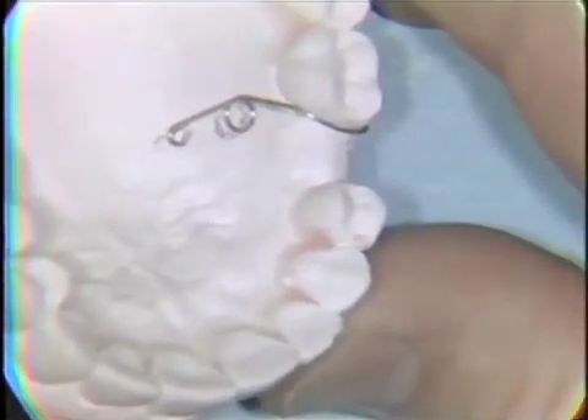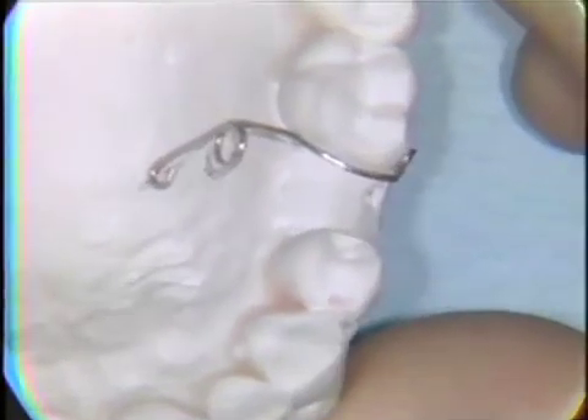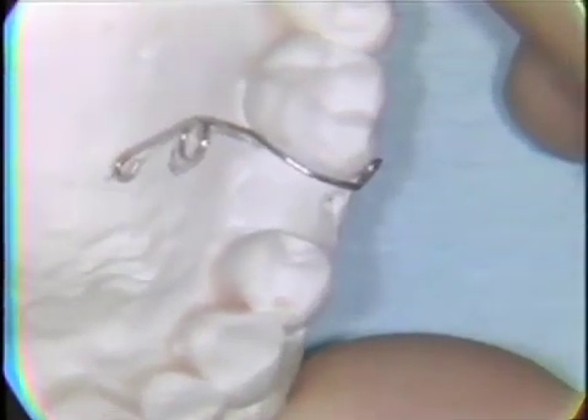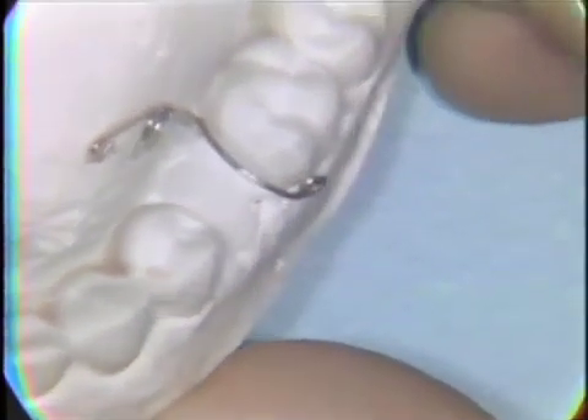The completed fingerspring should have the proper spring design to produce the most effective tooth movement. The helix should unwind in activation. The acrylic extension of the spring should be occlusal to the loop of the helix, and the spring arm should be to the gingival. The spring arm should adapt very closely to the gingival margin of the tooth as it extends in its contact through the proximal aspect around to the buccal.